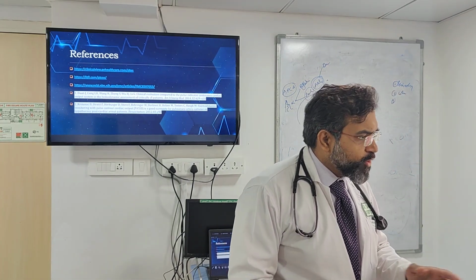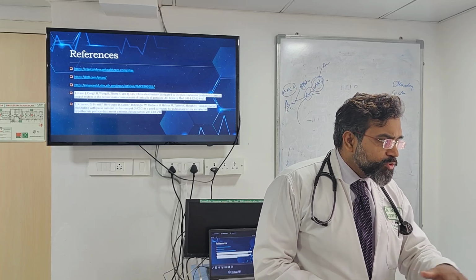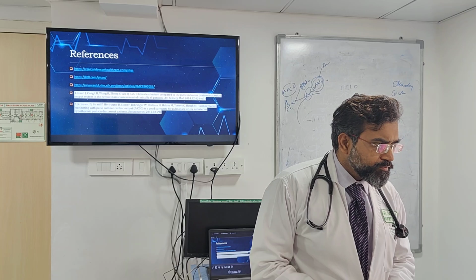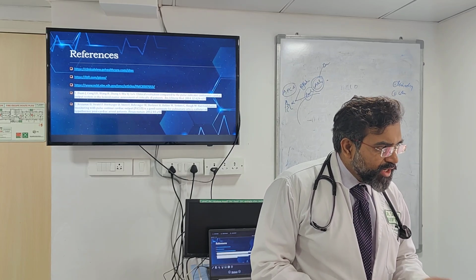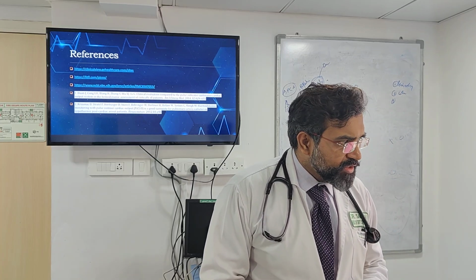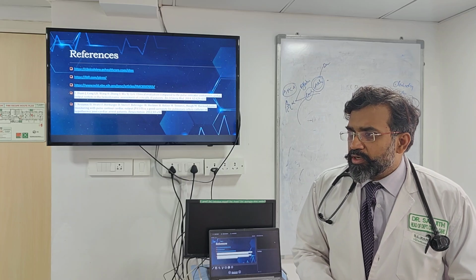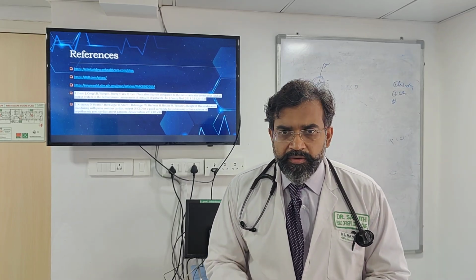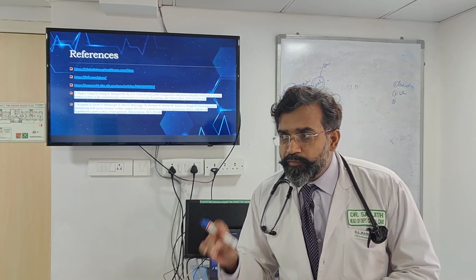In arterial pressure contour analysis, it looks at the waveform and then tells you the entire thing. But with thermodilution, it only takes the compliance. That's why it's telling you the entire answer, because the algorithm there is slightly different. So with this, it actually gives you the answer. That is why that is the gold standard.